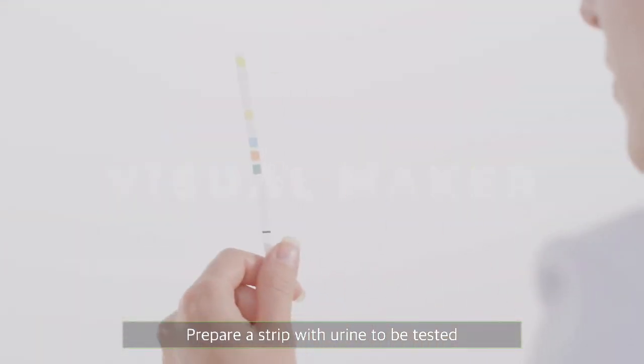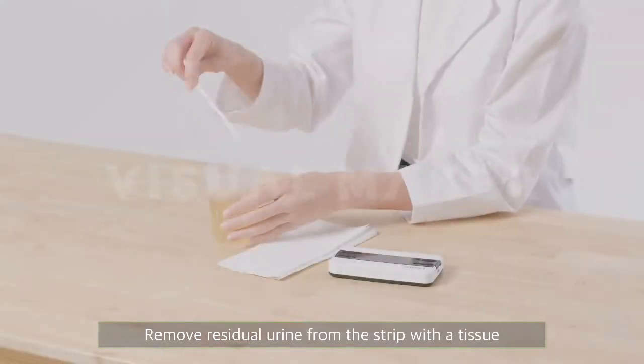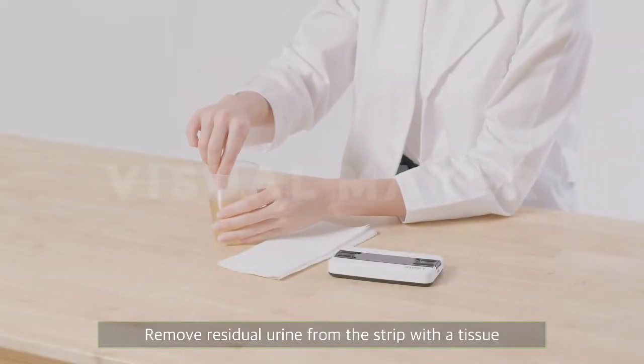Prepare a strip with urine to be tested. Remove residual urine from the strip with a tissue.